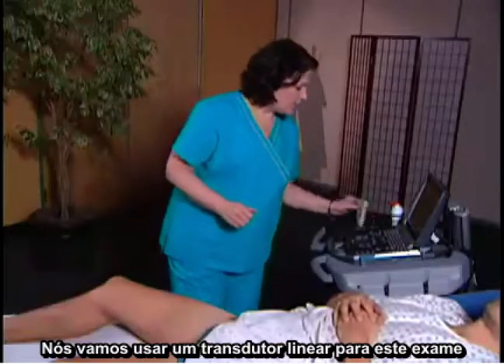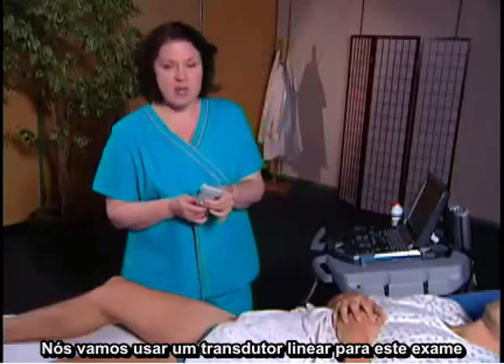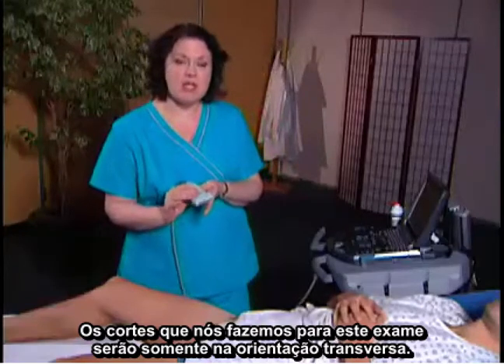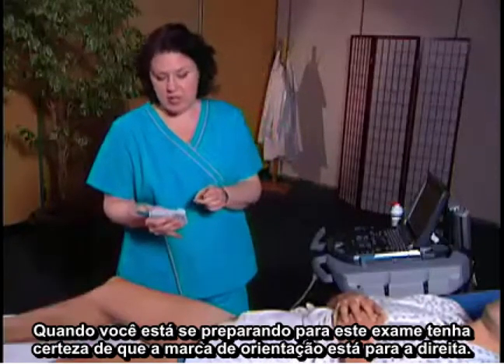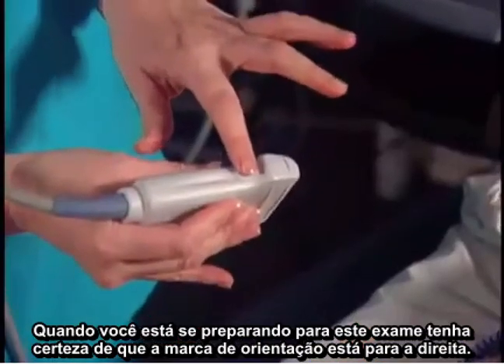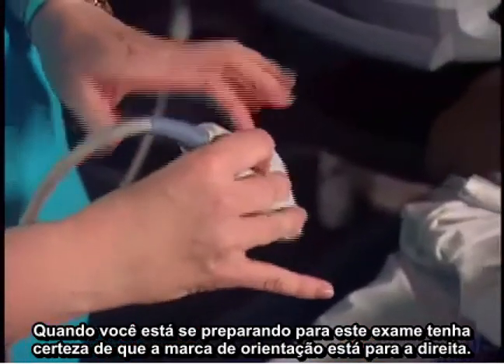We're going to use a linear transducer for this examination, and the views that we do for this exam will just be in a transverse orientation only. When setting up, make sure the orientation marker is to the right.